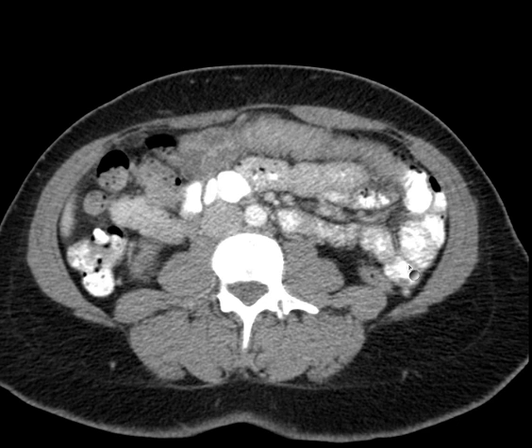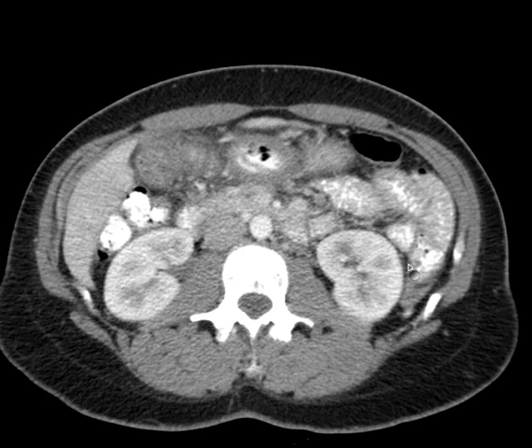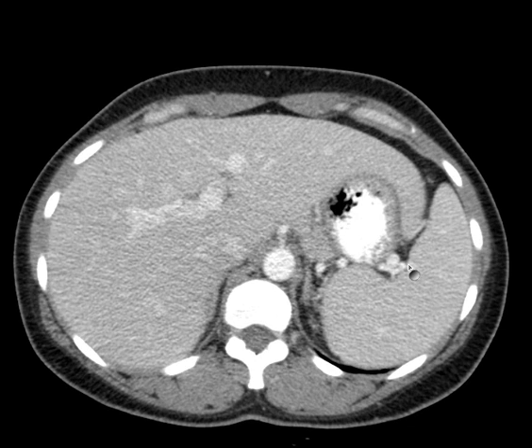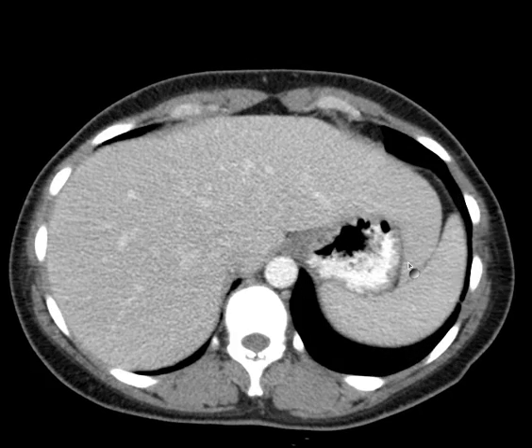I know we're going through the bowel segment of the course, and you're probably thinking in terms of anatomy or barium studies, but I wanted to embark on cross-sectional imaging because that is a lot of what we will be doing. It's important that you understand cross-sectional imaging, and believe me, you will by the time you finish the program. And I think we'll see many cases, and you'll get very comfortable with the basics of cross-sectional imaging.